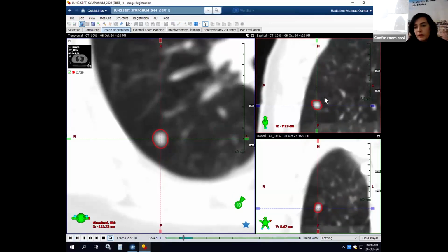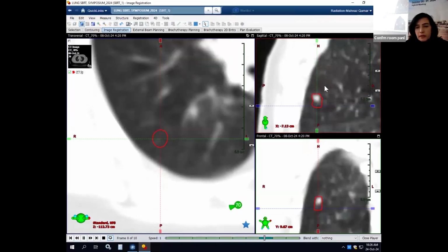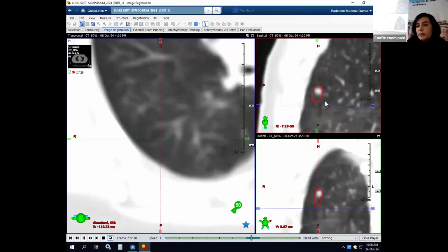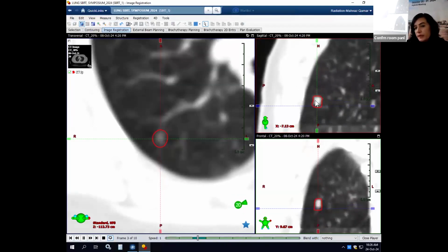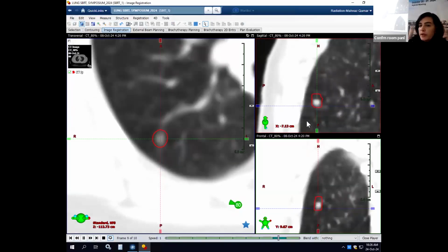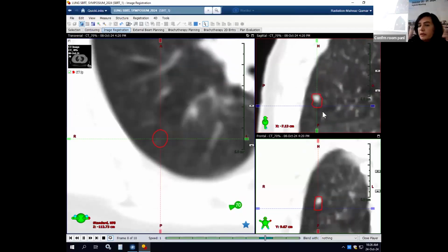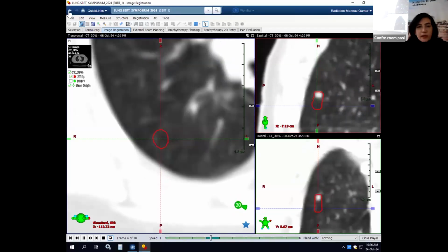So we can see the ITV, this is for the specified phases, and that's how the tumor motion is. Then our physician went ahead and gave, because we are accounting for the movement, and since there was a little bit more movement craniocaudal, just as a precaution, a 5 millimeter margin, which is our standard all around the ITV, the accumulated ITV. And then just to be on the safe side, a 6 millimeter margin, we usually give 6 to 7 longitudinal, or in the cranial caudal direction.